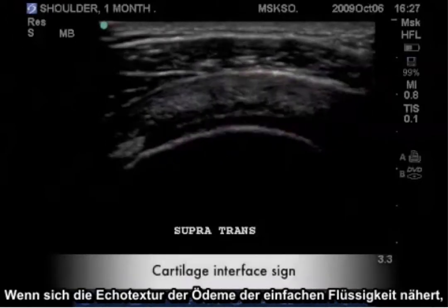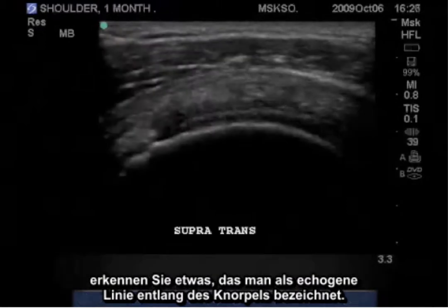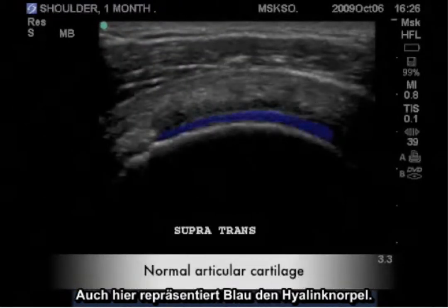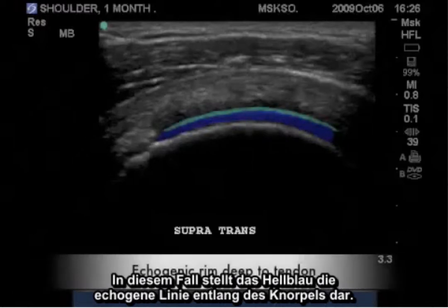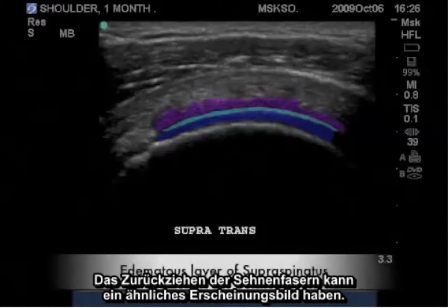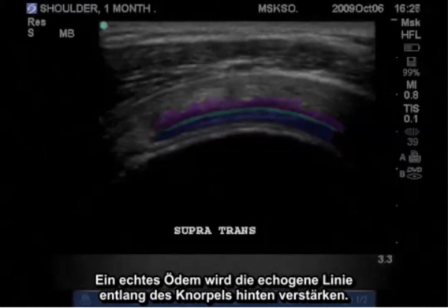When the echo texture of edema becomes closer to simple fluid, you will notice what is called a cartilage interface sign. Blue represents hyaline cartilage; the lighter blue represents the cartilage interface sign, and the purple represents the layer of edema. It is also important to note that retraction of tendon fibers may also give a similar appearance. True edema will posteriorly enhance this cartilage interface sign.